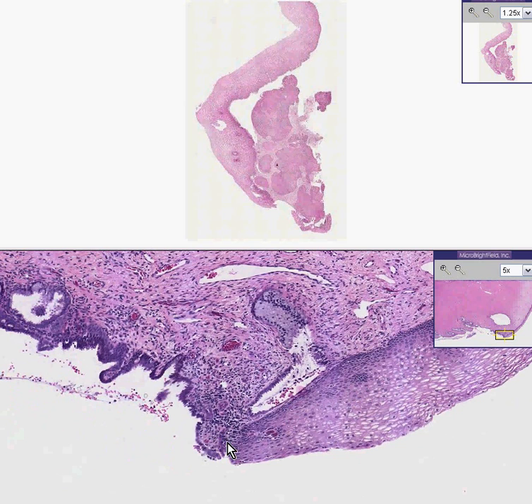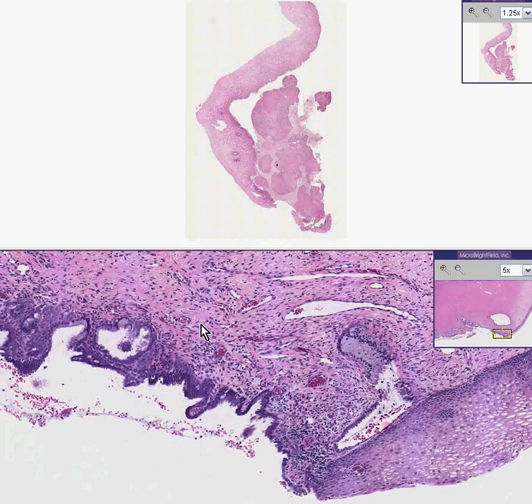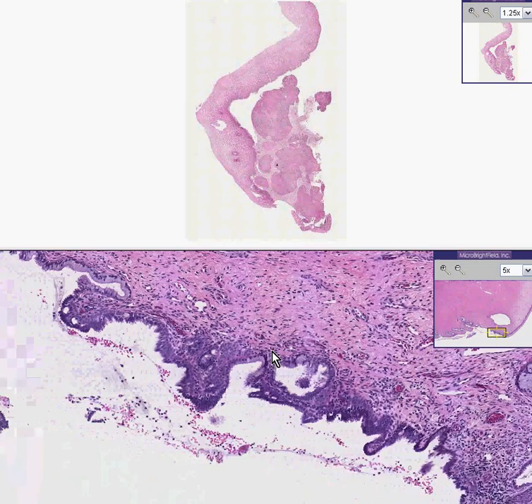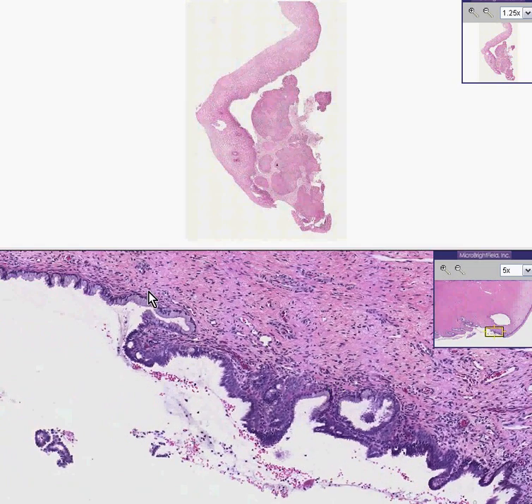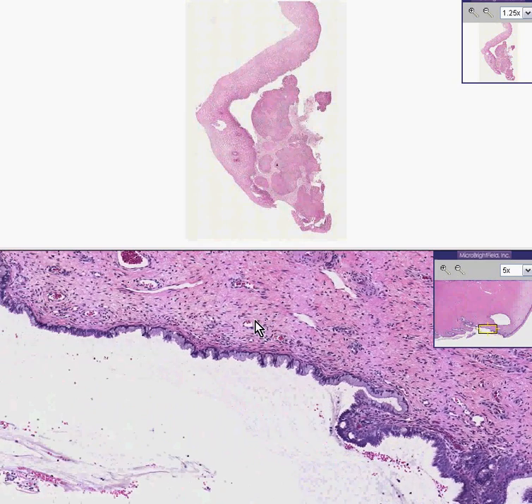Notice there's a fairly abrupt transition right here before you start getting into the columnar epithelium. Also note there's a scattering of inflammatory cells. This is so common — just to see scattered lymphocytes — you would never really want to call it inflammation. You never see it where there are no inflammatory cells.